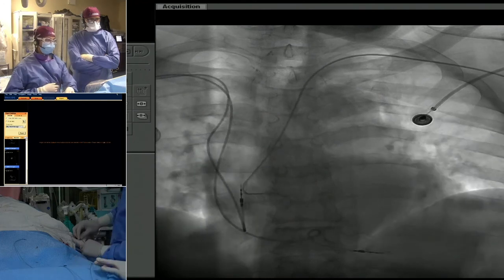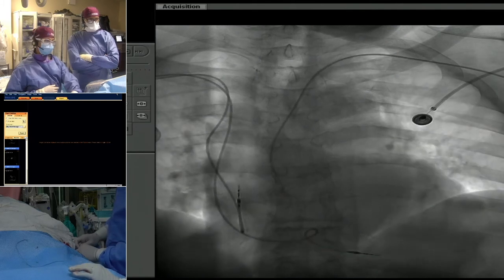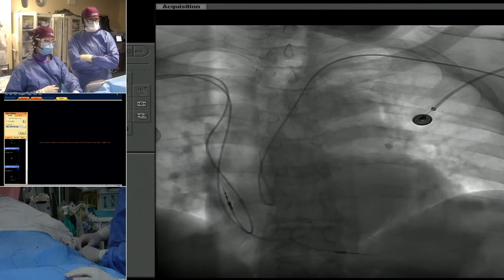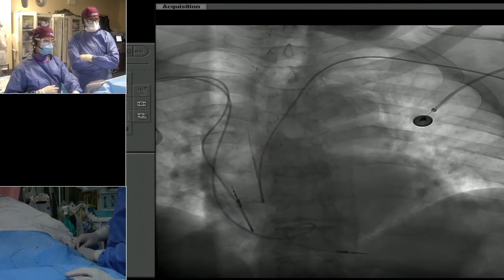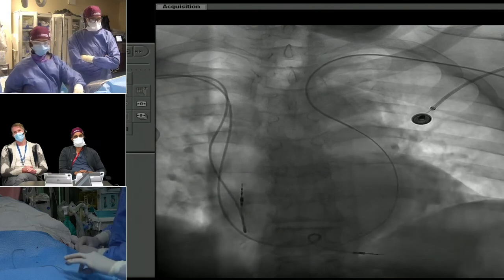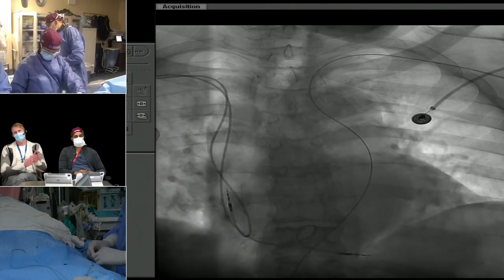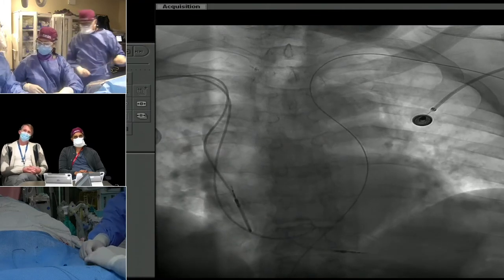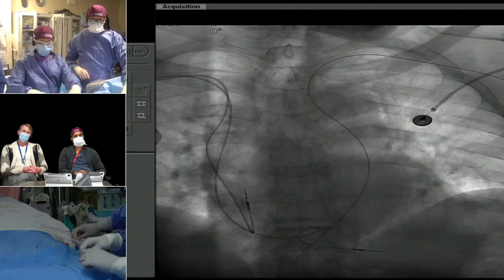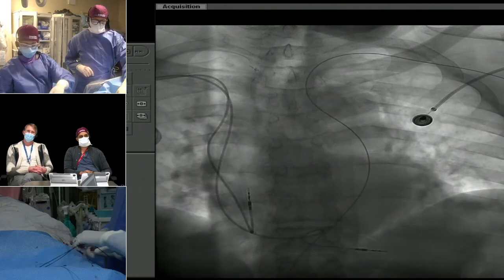So this is pretty challenging anatomy just in general. Elderly men, I tend to find, have this tortuosity more than elderly women, but that's just my personal experience. So you can see the tortuosity there. I'm going to take this catheter out, and now we're just going to go down with the radial catheter. It takes about 30 seconds to do that, and it works every time, as opposed to using different wires and catheters. I think that's the best way to do it.